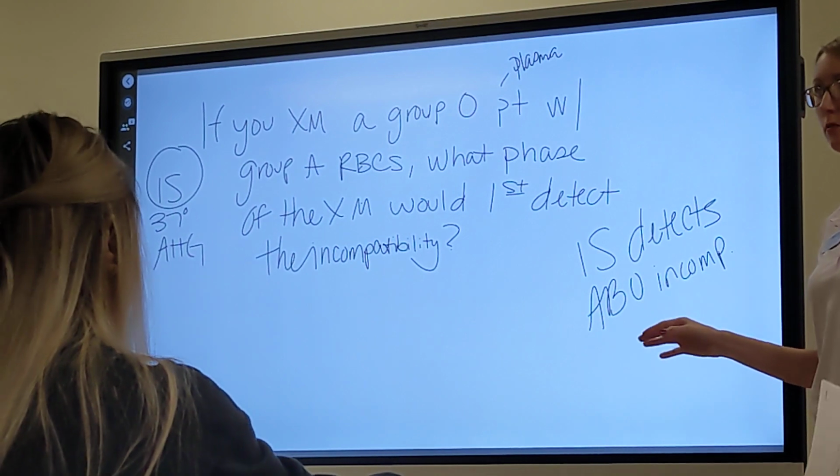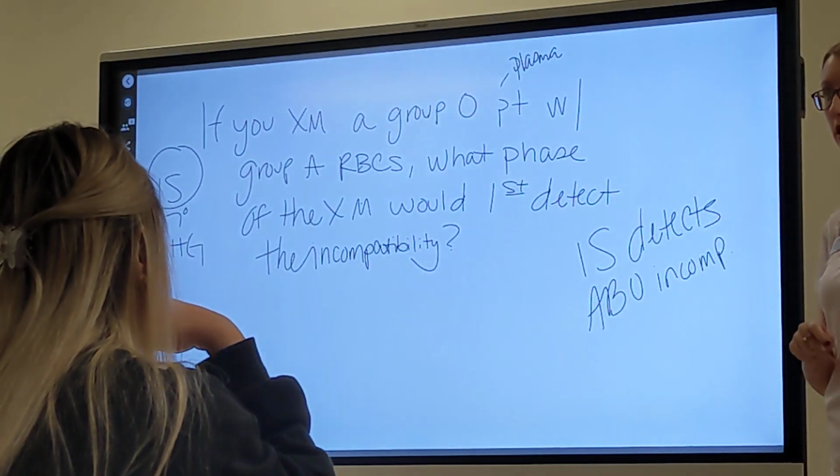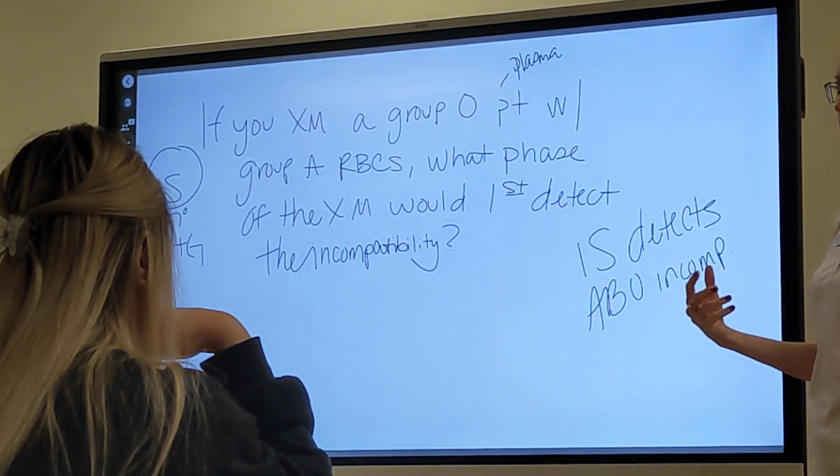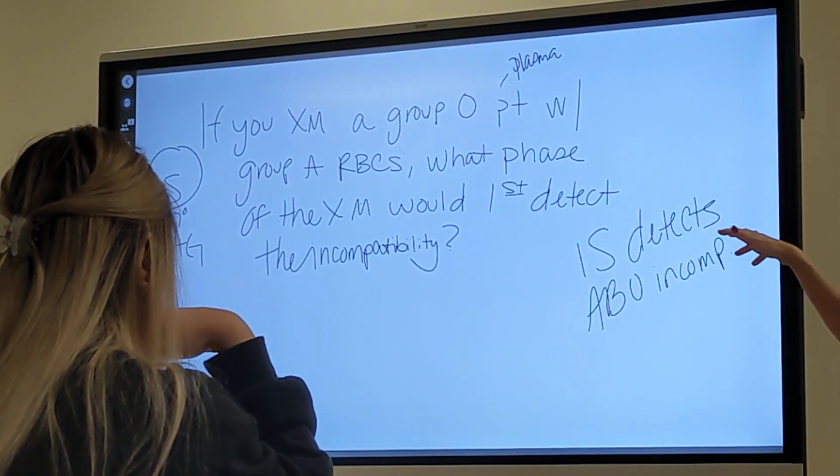Any agglutination, which is what is gonna happen, means that it's gonna do the same thing in the body. I mean, technically, the immune system's gonna remove them from circulation, but this, in the tube, is kind of showing you what to expect.